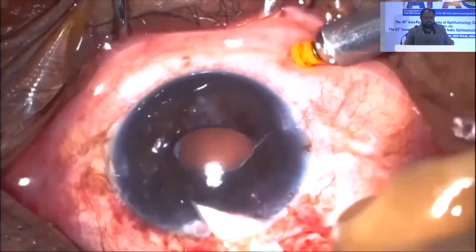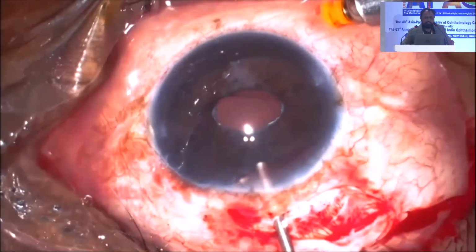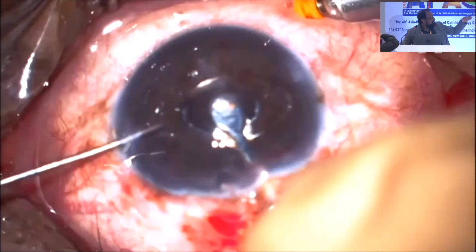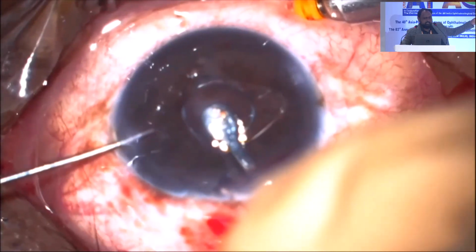So once a thorough anterior vitrectomy is done, make sure all the strands are clear, make sure the viscoelastic is put in, and make sure you position the lens where you want to clip. The second tip here is I usually take my second instrument inside first to the mid periphery of the iris where I'm going to clip, and then take the lens inside. By this, I know exactly where I'm going to clip.